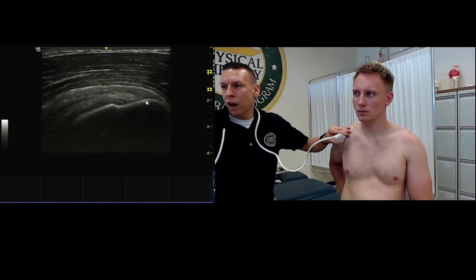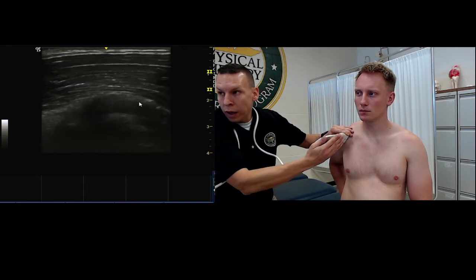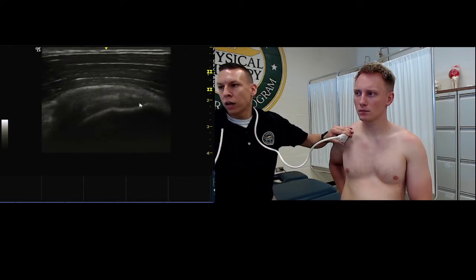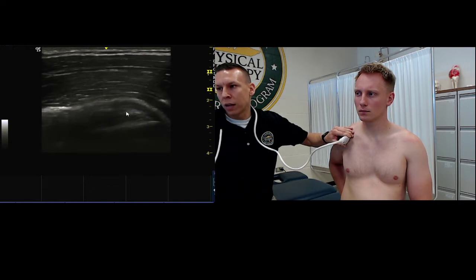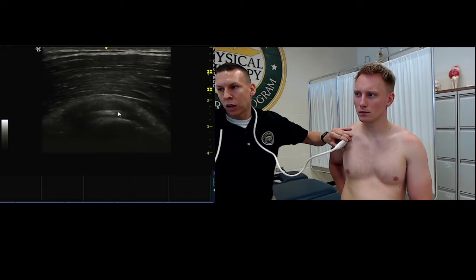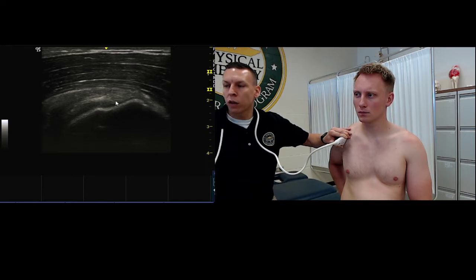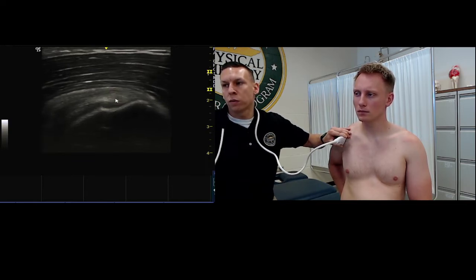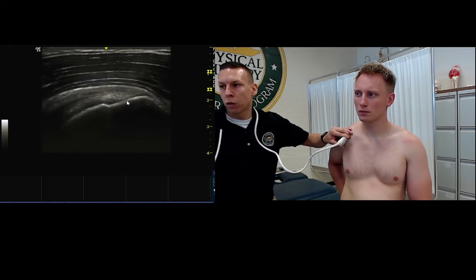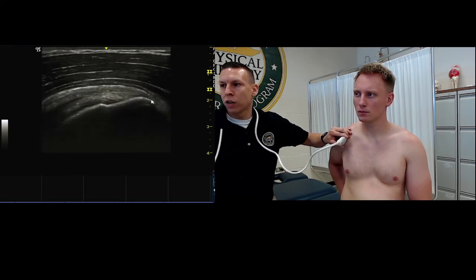Now, if you're having a hard time finding it, slide the probe all the way until you run into the biceps tendon here. Once you run into the biceps tendon, then you're going to move just a little bit lateral until you're right at the edge of the greater tuberosity. The reason we want to do that is because the majority of supraspinatus tears actually occur at the most anterior portion of the supraspinatus. So here we're looking for this S-shaped curve, and we're looking for these fibers coming in and attaching down to the bone here.